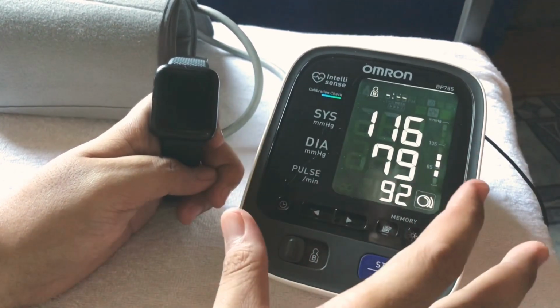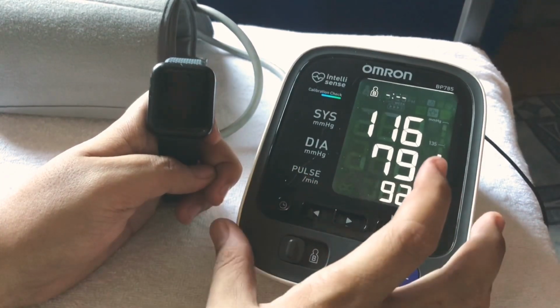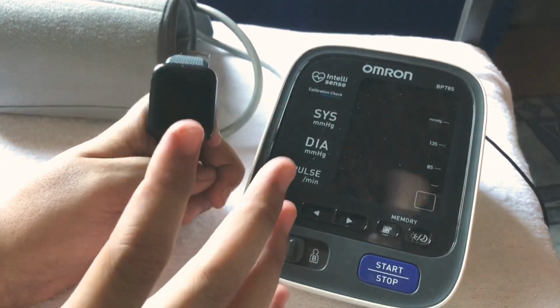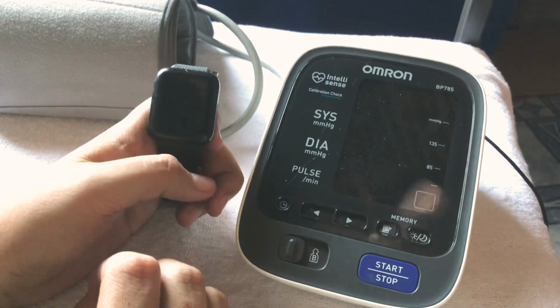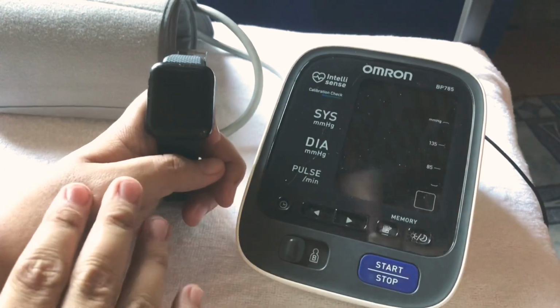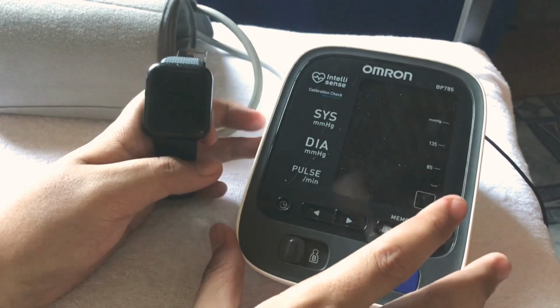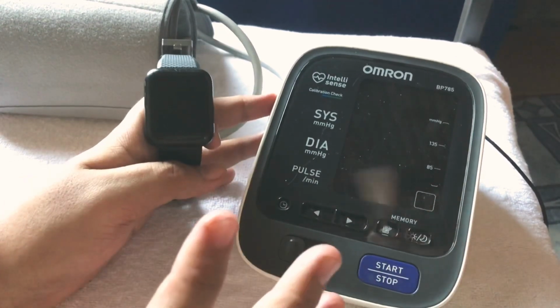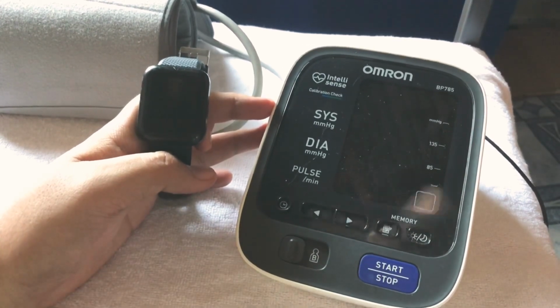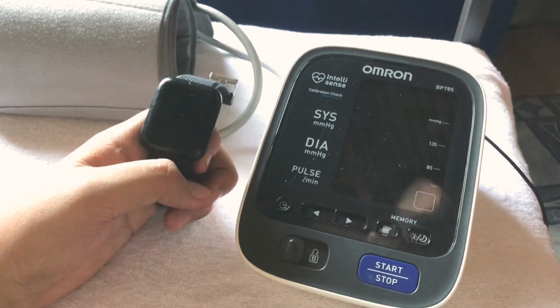So if we compare the diastolic, it's almost the same. We've got 79 with our Omron, and for our 116 Plus smartwatch, we've got 80. And also for the systolic, we have 108 for our smartwatch, and 116 for our Omron blood pressure monitoring kit. So although it's not really that accurate, somehow we can say that it's a little accurate, guys. I'm just testing it for curiosity's sake.